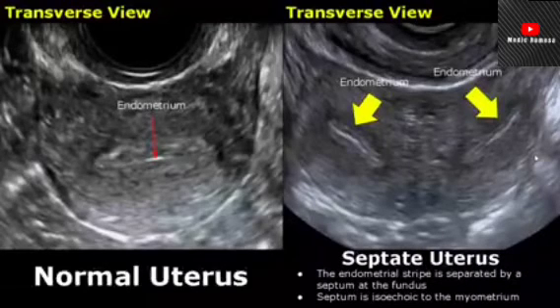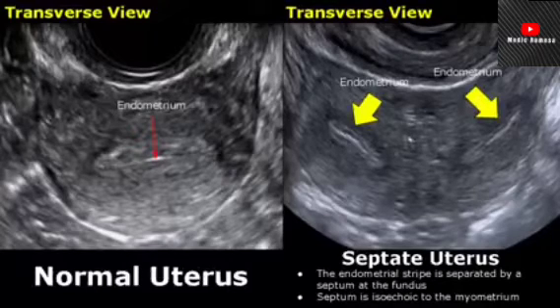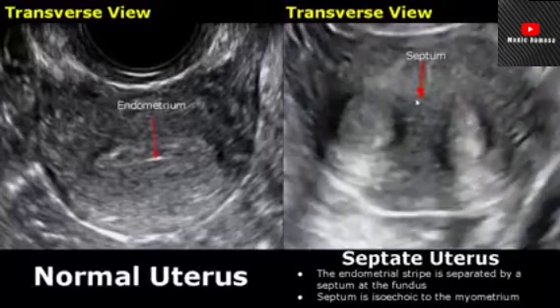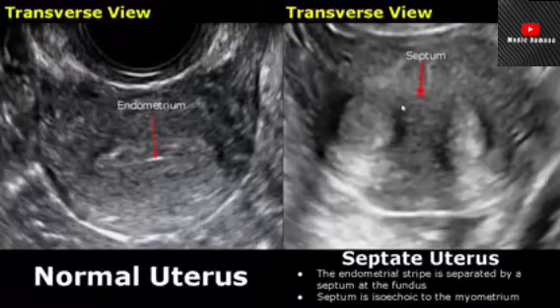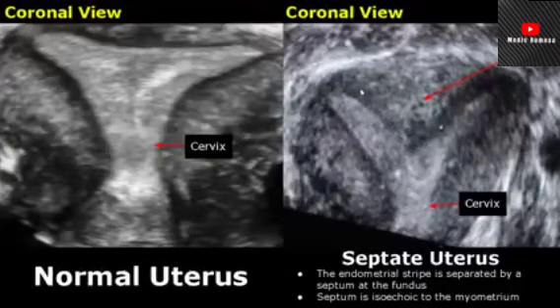In a septate uterus, the endometrial stripe is separated by a septum at the fundus. In transverse view, the septum divides the endometrial stripe and is isoechoic to the myometrium. In coronal view, we can see a thick isoechoic septum in the middle of the uterine cavity.